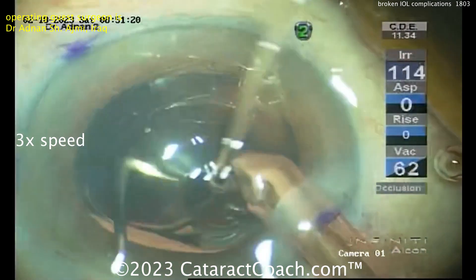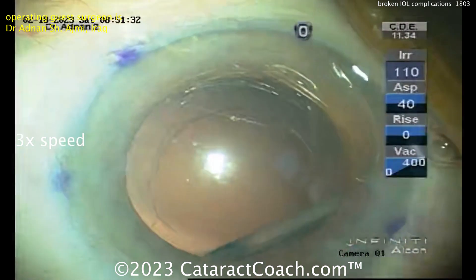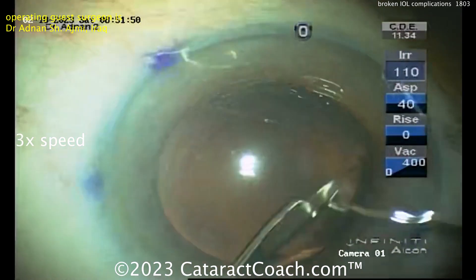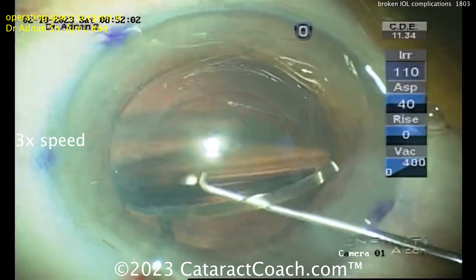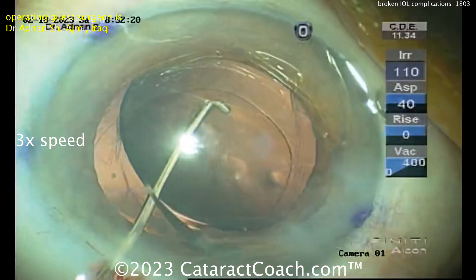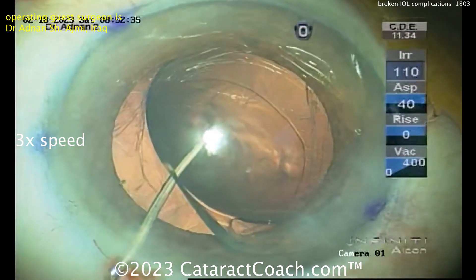Whoa! That lens is looking really deep — there you go. That's the edge of the lens. The lens is now dangling in the mid-vitreous. Somehow this lens was damaged, broke, and popped right through the posterior capsule. Very carefully, the surgeon is using some hooks here. This is where your blood pressure goes really high and your pulse goes really high too — you feel the sweat building up. You're so stressed out. But we can save this.